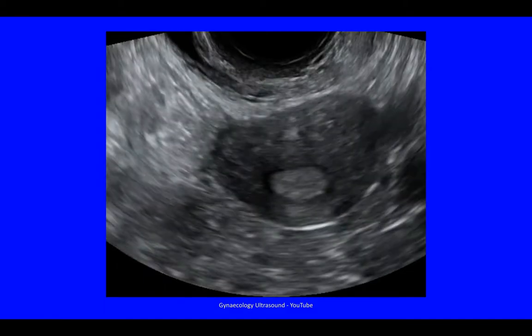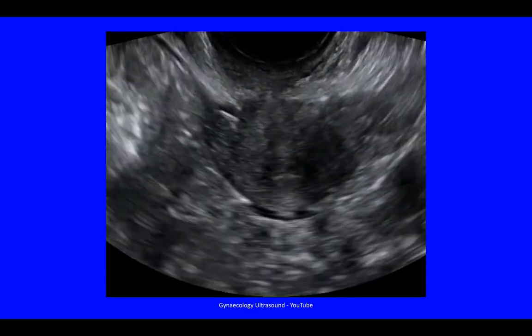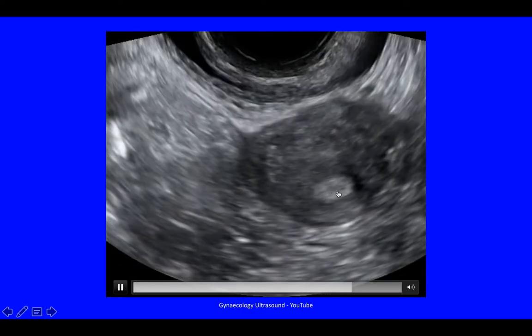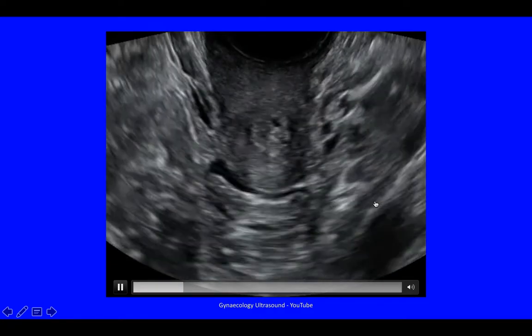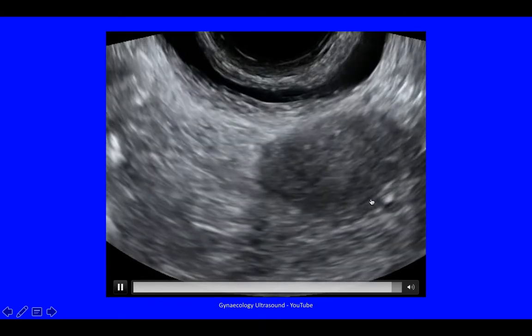Here's the video again, starting at cervix with cervical canal, going up into the endometrial cavity, into the interstitial portion of the fallopian tube, just there.